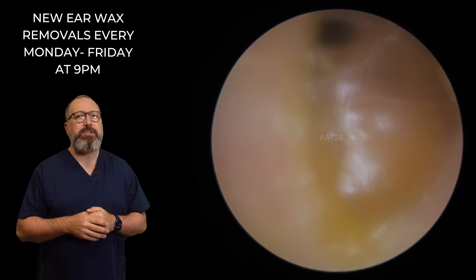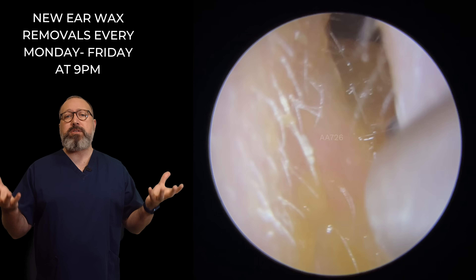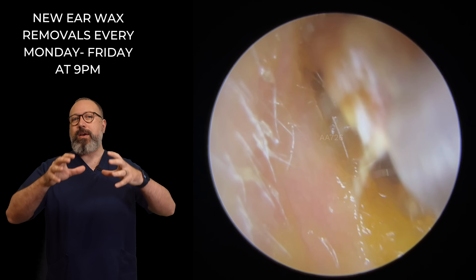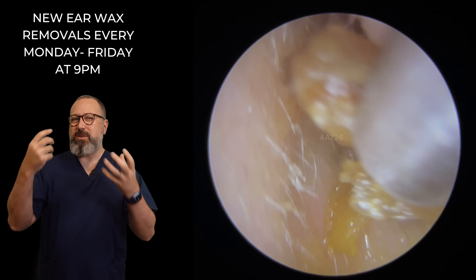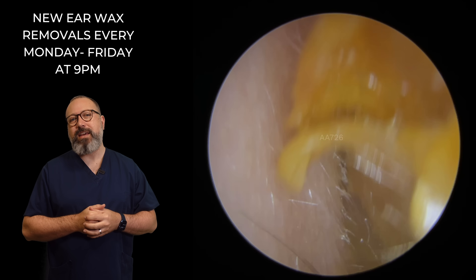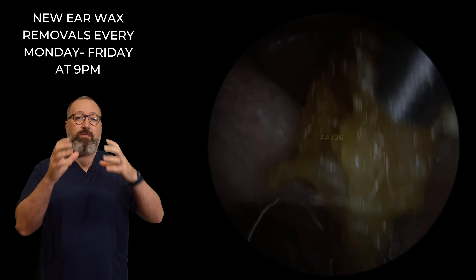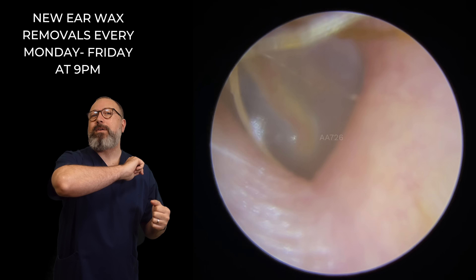This is the second patient in the compilation — we can see a much softer wax. People are genetically predisposed to one type of wax or the other, some dry and some wet. What we have here is wetter wax at the entrance, most likely because the patient has been using olive oil to soften it up. As we pull this out, we've got a blob of wax on one side, a blob on the other, and a little sleeve of skin in the middle holding those two pieces together. On first glance the patient didn't look like they'd have too much of an issue because I could see a gap through the wax.